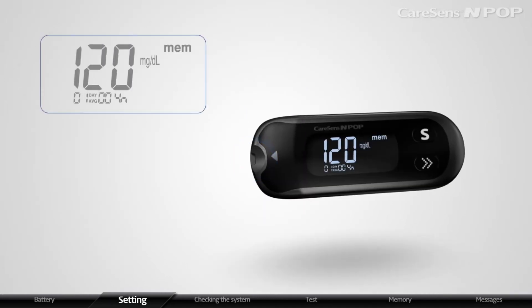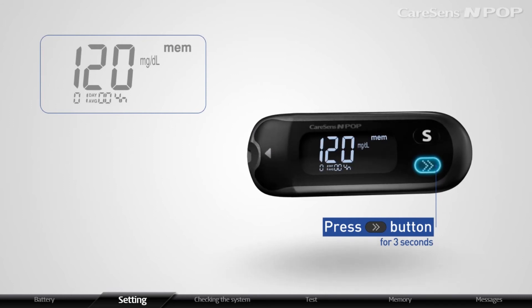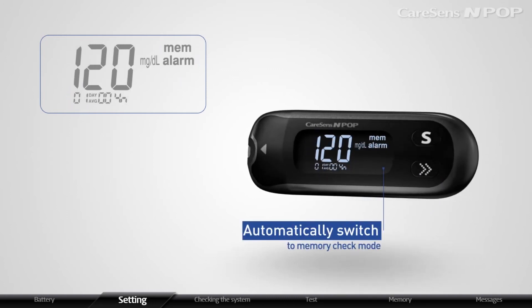When the strip is not inserted, press the arrow button for 3 seconds to set the PP2 alarm. After displaying PP2, alarm, and on, the meter will automatically switch to memory check mode.